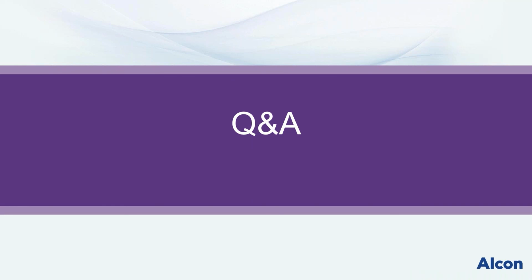Interesting question here. We had one actually that we addressed, and again, this is a clinical question. Probably you're not the best person to ask about the particular lens design, where people are finding they have to push more plus with the DT1 than they normally would for patients. I'm assuming that has something to do with the design of the lens, but that is actually an accurate observation, at least for me.